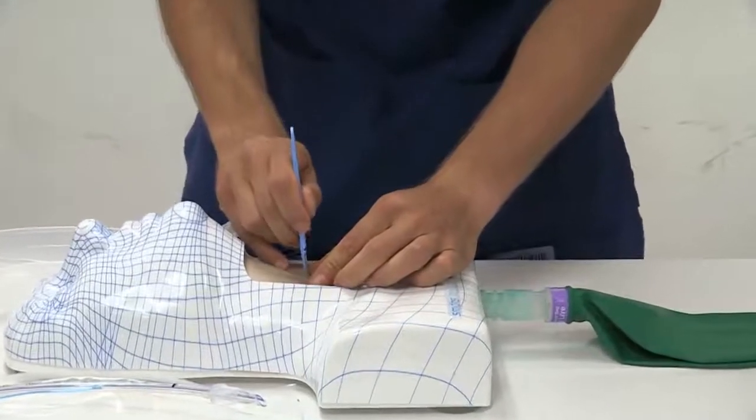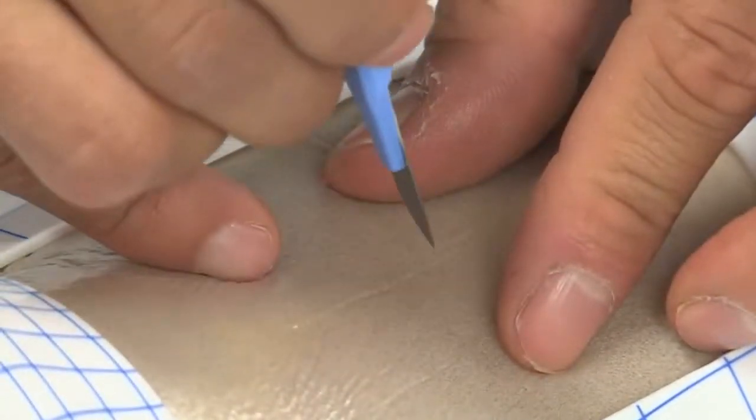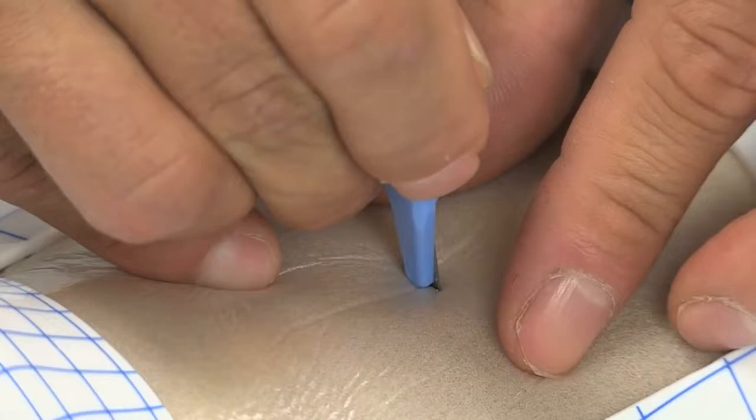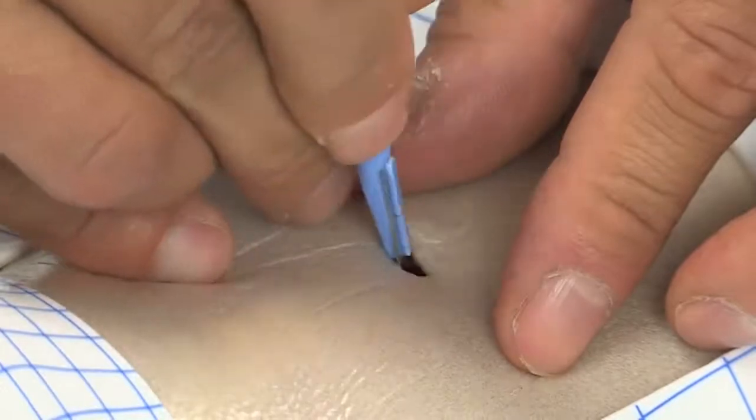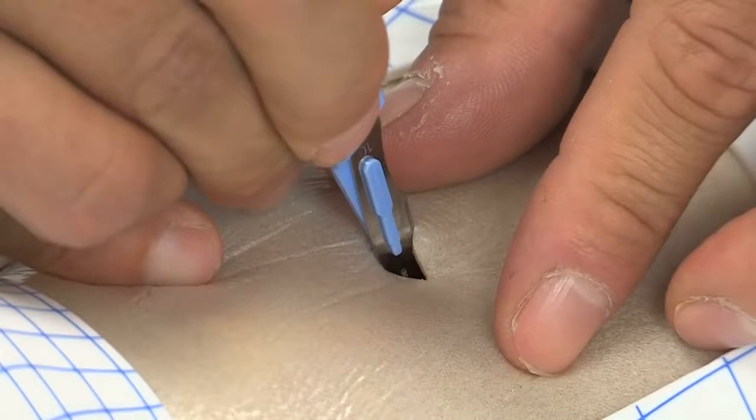Using the dominant hand, a stab incision is made into the skin and underlying airway using a size 10 scalpel with the sharp edge towards you. After feeling a pop as the blade enters the airway, gentle traction should be applied to the scalpel before it is rotated 90 degrees with the blade sharp edge ending up pointing caudally.